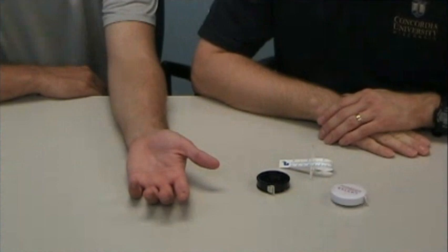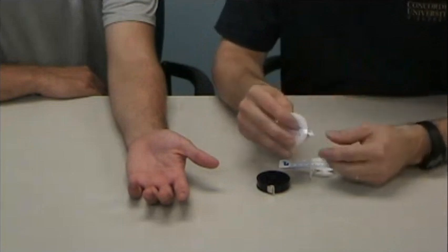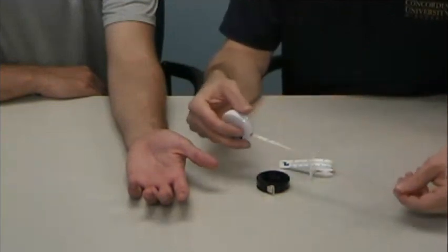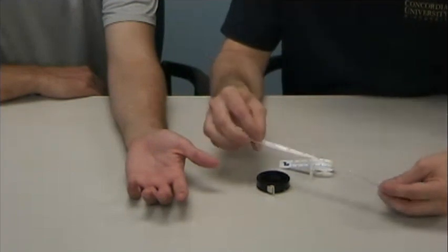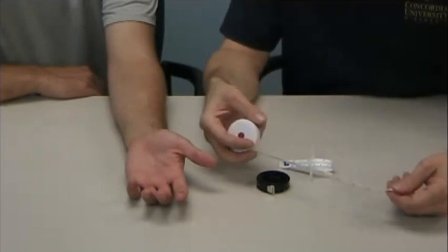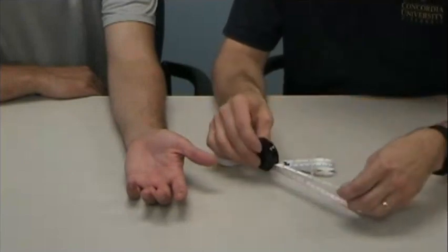In this video, I want to briefly describe the procedure for performing circumferential measurements to measure edema. Circumferential measurements are typically done with just a measuring tape, recorded in centimeters and millimeters as opposed to inches. There are a variety of tools available to do this, and I'm going to show you a couple different ones.